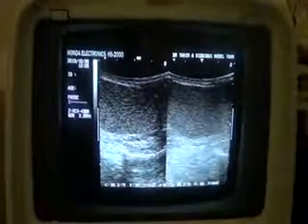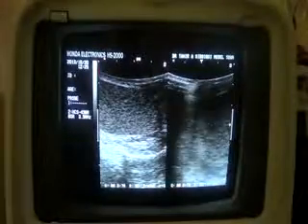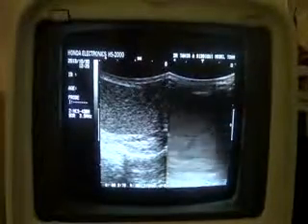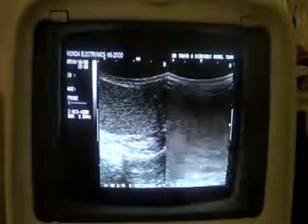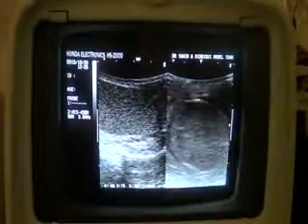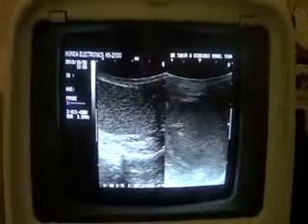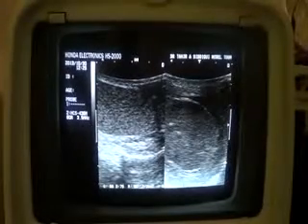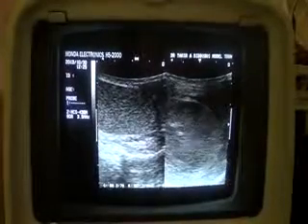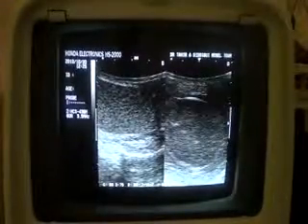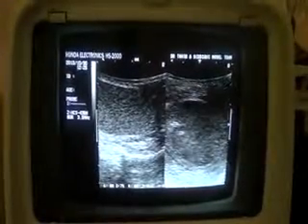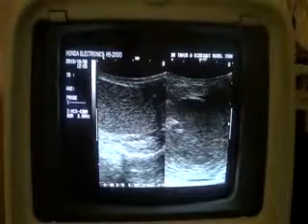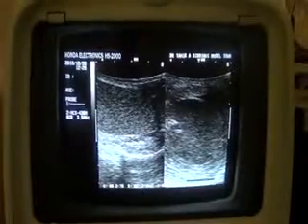Now I am going to show you the right testis. This is the longitudinal section of the right testis. So this is the case of orchitis.